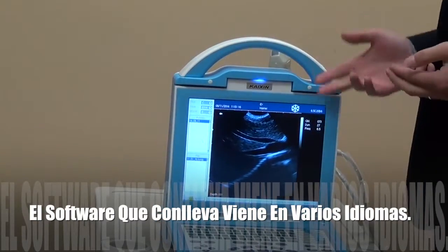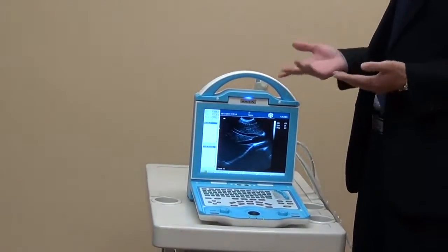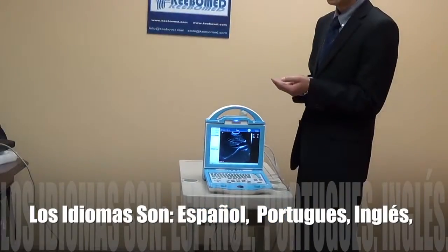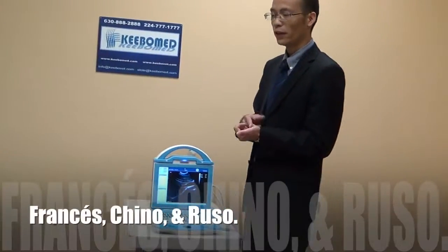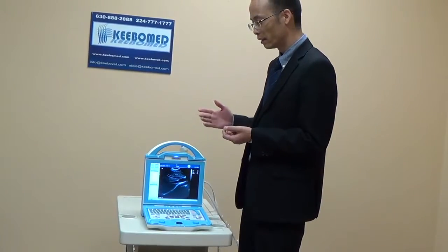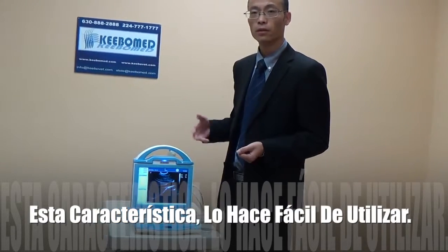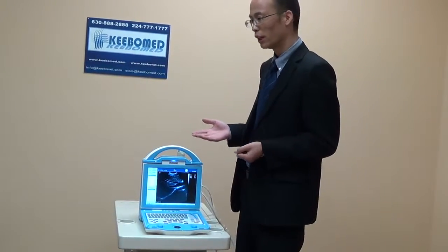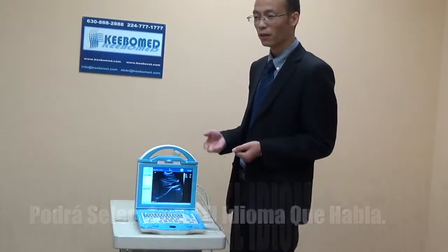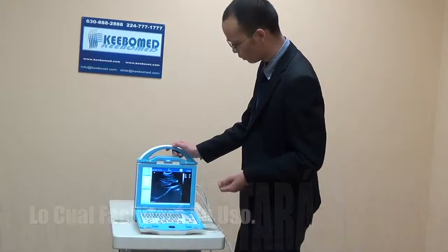The operating software of this main unit comes with multi-language support, including Spanish, Portuguese, English, French, Chinese, and Russian. It is very user-friendly, so you can select the exact language you are most familiar with.